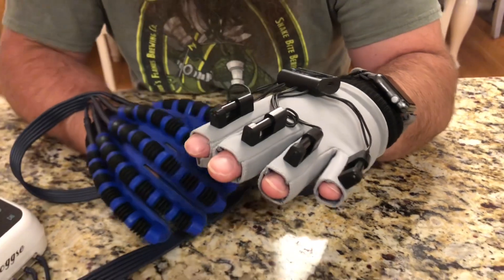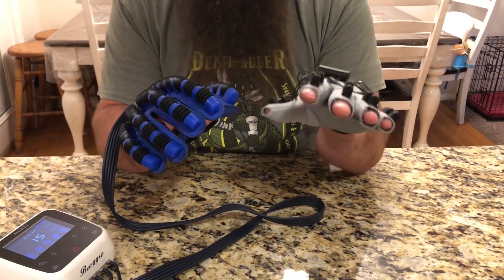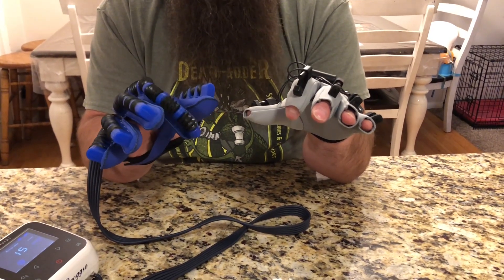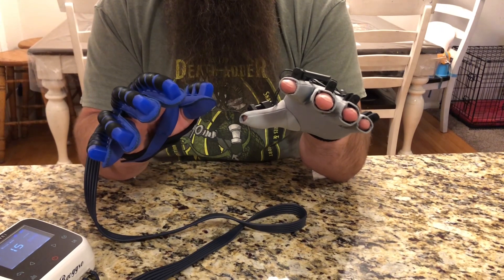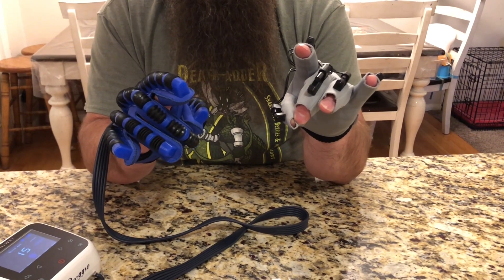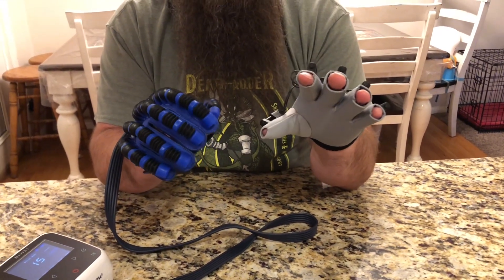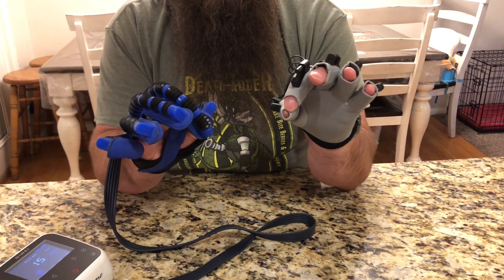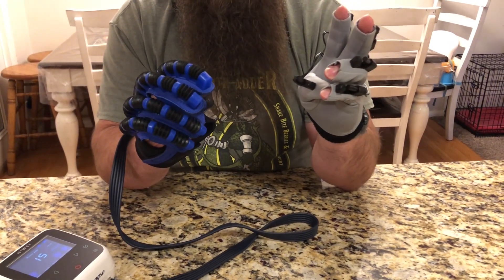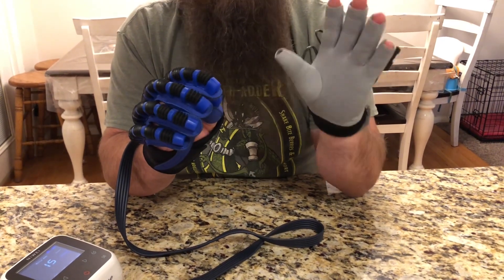I've got all those set, so now I'm going to start this mode. It uses my left hand to train my right hand. If I move any of my fingers, it makes that finger on the other hand go. If I do two fingers, it does both. If I bring two together, it brings both of those together. If I squeeze the whole thing, it brings my whole hand in. So it mirrors one side to the other, and I can go through touching each finger to train one hand using the other.